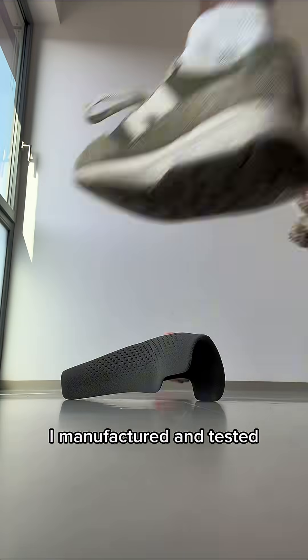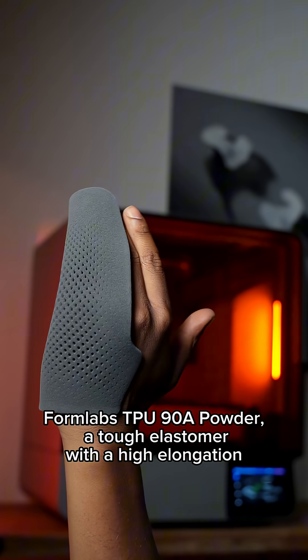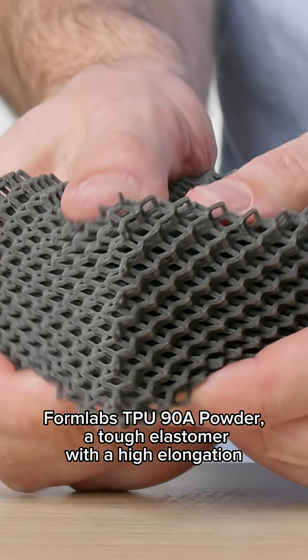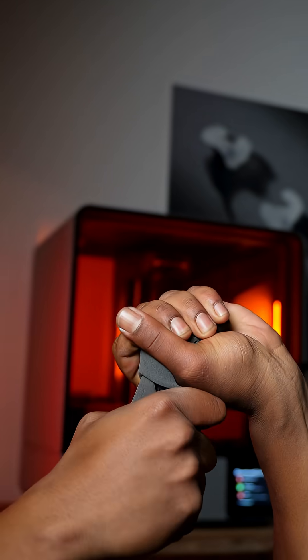Now for Part 2, I manufactured and tested a flexible and strong powder-based SLS printed orthosis using Formlabs TPU 90A powder — a tough elastomer with high elongation at break performance and superior tear stretch. Just like in Part 1, the process started with capturing a digital impression of his hand.